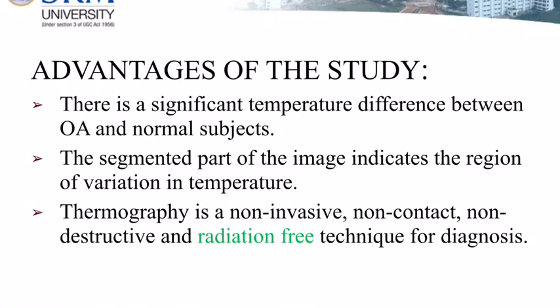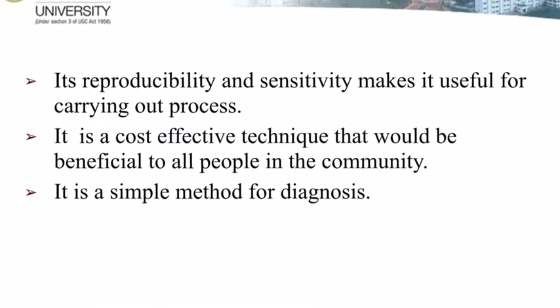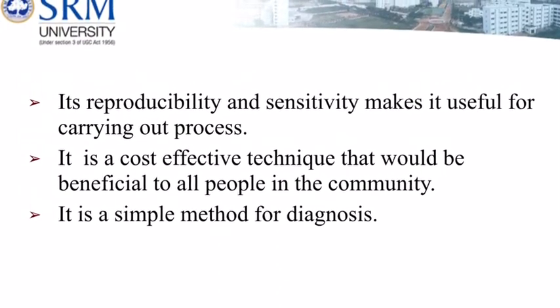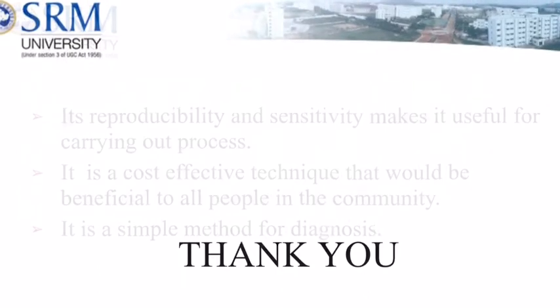Thermography is a non-invasive, non-contact, non-destructive, and radiation-free technique for diagnosis. Its reproducibility and sensitivity make it useful for carrying out the process. It is a cost-effective technique that would be beneficial to all people in the community. It is a simple method for diagnosing osteoarthritis.